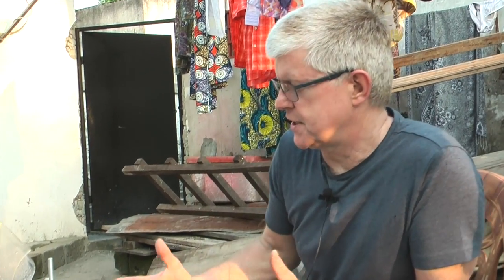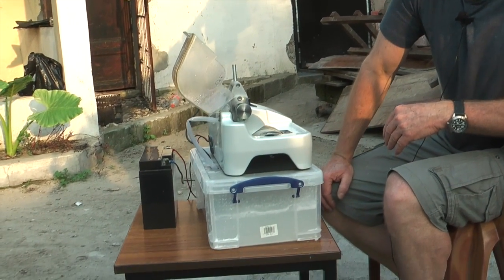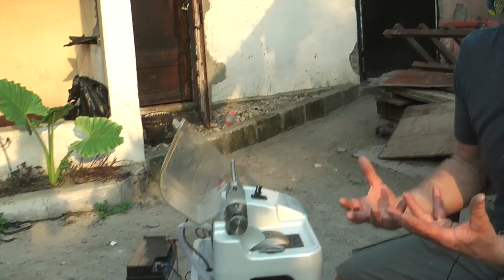Here we are in Kinshasa, in the Democratic Republic of the Congo, and we want to introduce this little solar-powered lens cutting machine. It's been developed by Mission for Vision to enable us to provide glasses in these very remote areas. Although Kinshasa is a big city, the power supply is not adequate enough for us to be able to use sophisticated lens cutting equipment.